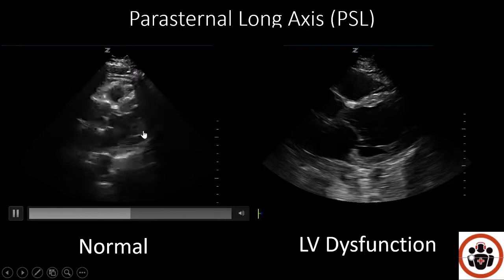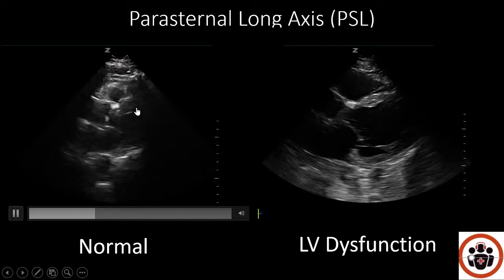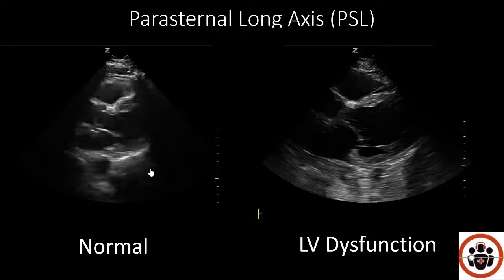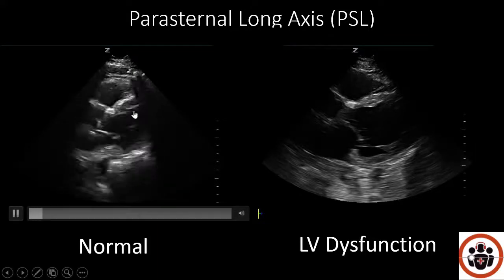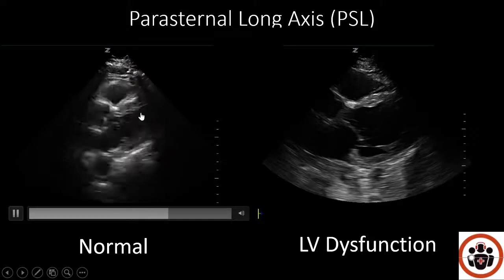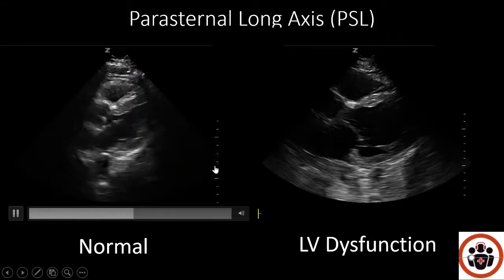If you look at the middle of the left ventricle, you can see that the walls are coming together. The muscular wall is coming closer to the muscular wall over here. And when the heart transitions from diastole to systole, you see that the heart is contracting more than 1/3 of its diameter. Finally, when you look at the width of the left ventricle, you can see that it's not more than 5 centimeters. Here's our centimeter bars on the side here.